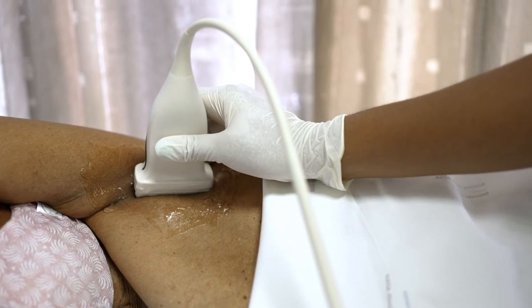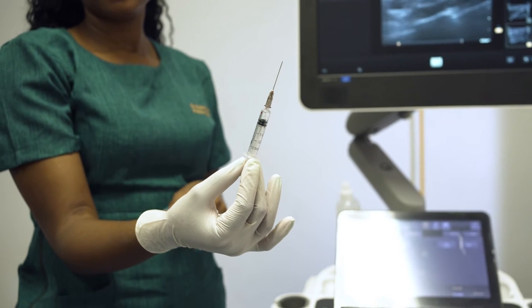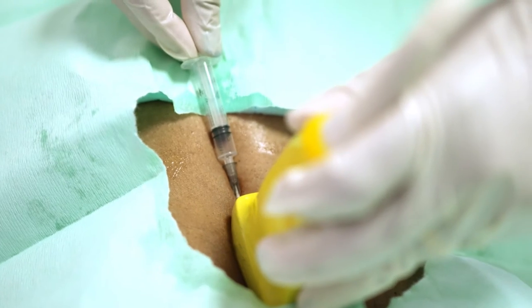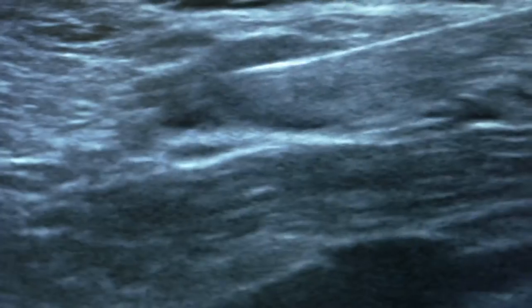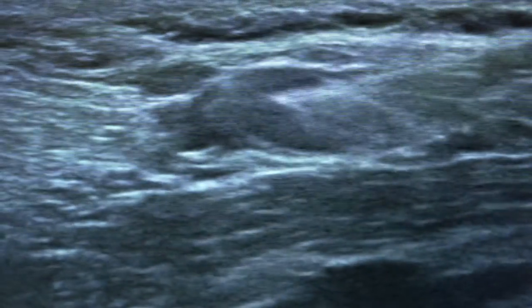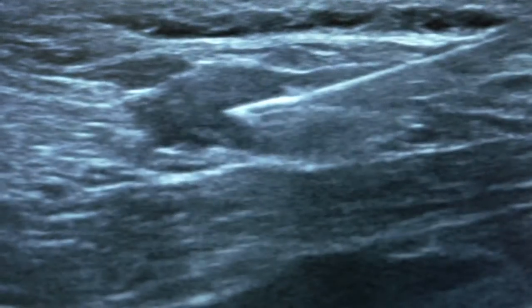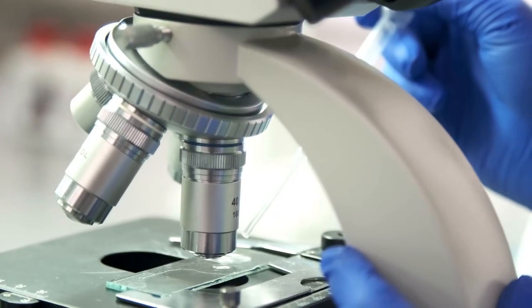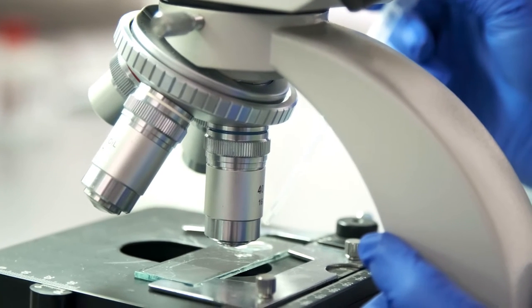Fine needle aspiration, or FNA for short, is a procedure where we use a thin needle attached to a syringe to remove the fluid and cells from lymph nodes under the skin. We use an ultrasound machine to visualize what is under the skin so that we can identify the lymph nodes and avoid other surrounding tissues, such as blood vessels. Once we've been able to take the sample, it is then taken to the laboratory to look at the cells under the microscope.